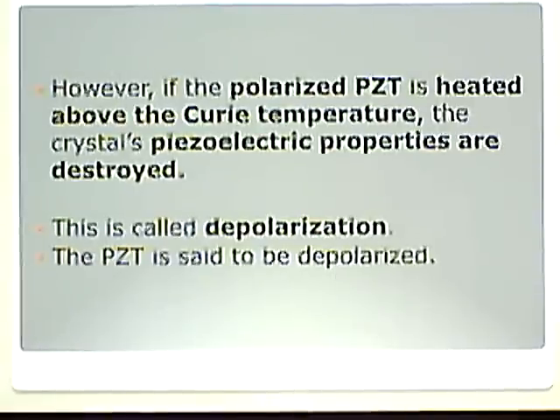Now, it's important to understand, if the polarized PZT is heated above that temperature, even 1 degree above, the crystal's piezoelectric properties are destroyed.